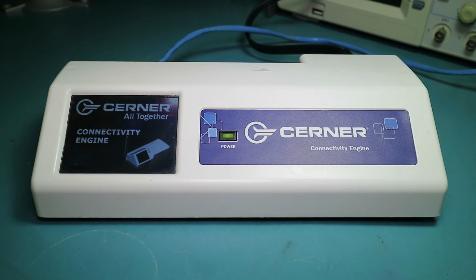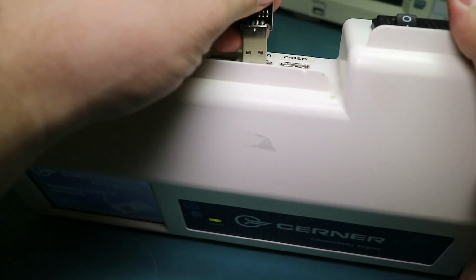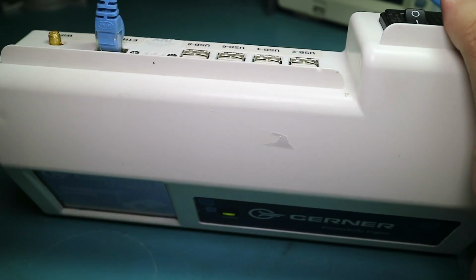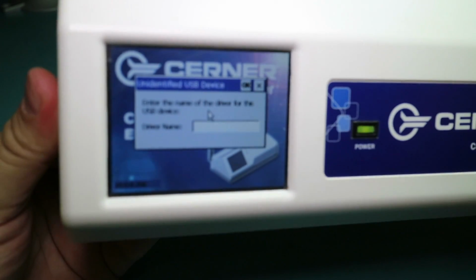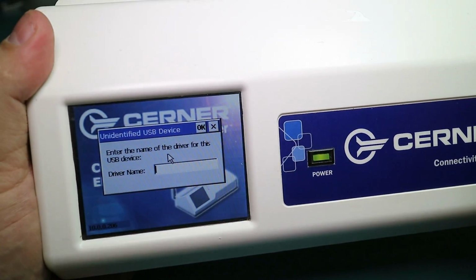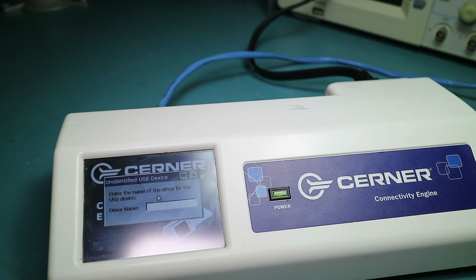If I take a USB device such as, this is just a simple USB serial converter. There's a whole bunch of USB ports at the back, which we'll get into, but plug it in and you get an unidentified device warning from Windows. So I tried every single device I have here, basically just trying to get anything to register and see if it actually pops up like a UI for, say a printer or something like that. And I couldn't get it to detect anything.